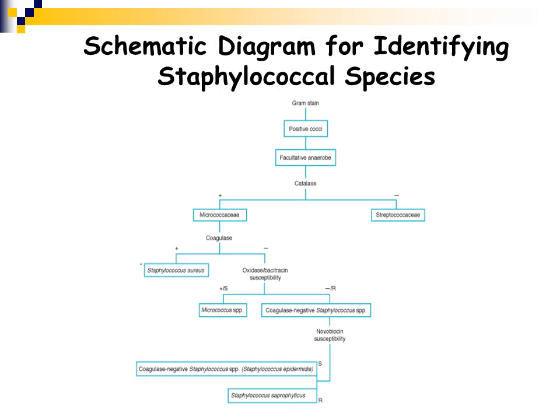This is a flow diagram of the Staphylococcus species. So you have a gram stain and you find a gram-positive cocci. The organism is facultative. It grows in CO2, grows in ambient air. It's not fussy at all. First thing you do with a gram-positive cocci is a catalase test. If it's catalase negative, it would be indicative of one of the family members from the Streptococcaceae family. We're going to talk about that group of organisms next.